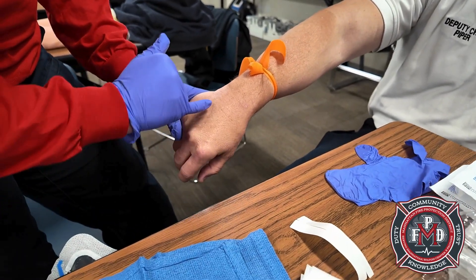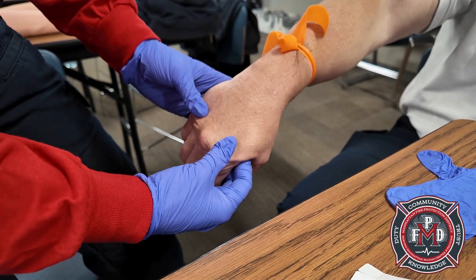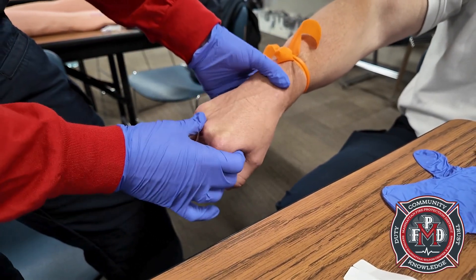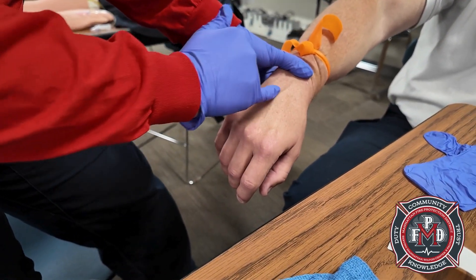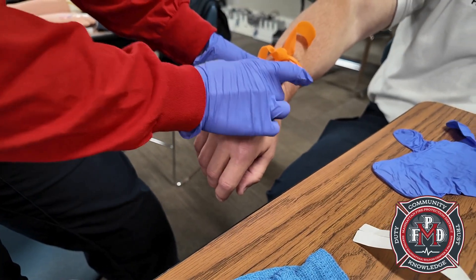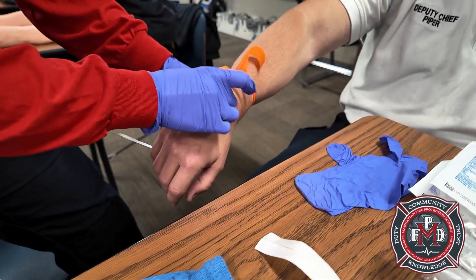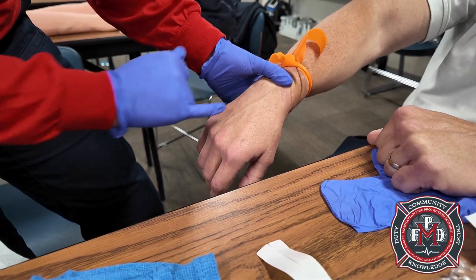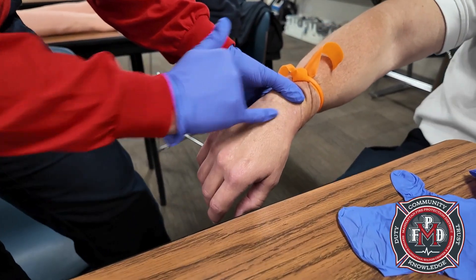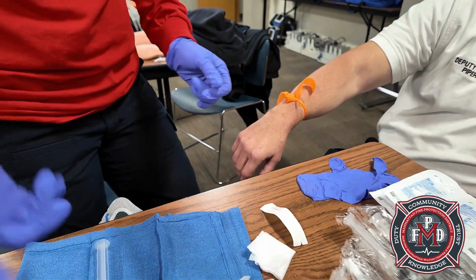See those little bubbles? Those are valves. It is possible to go through the valve with the needle, but sometimes it can blow the vein. You can flick the vein to plump it up. This one's good too.